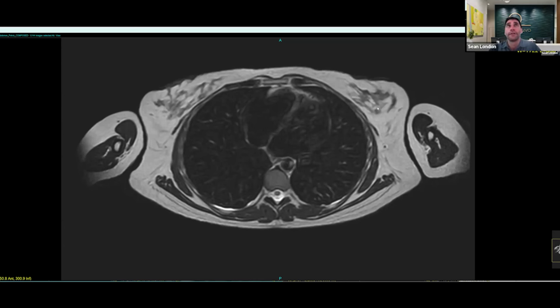And then what you're really trying to do is optimize your techniques, even mammography, by doing something called tomosynthesis. And with MRI, adding contrast can really help highlight those masses in the background of dense tissue. Now, breast MRI with contrast is not necessarily needed for every person. It's generally reserved for higher risk people or for problem solving. And high risk can be assessed with your doctor. They can do a profile assessment and determine if you're at a higher risk than the average population.